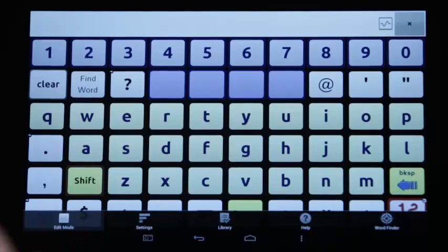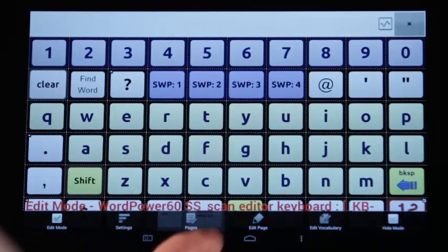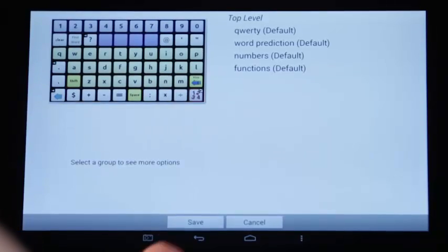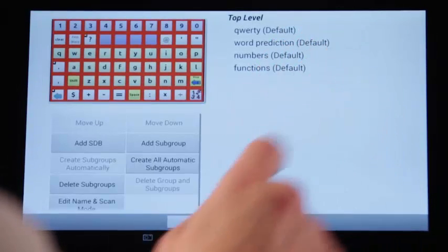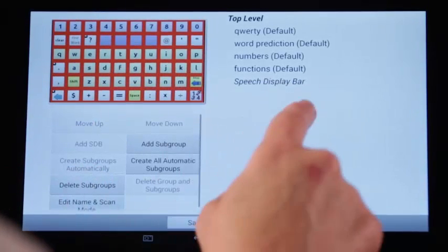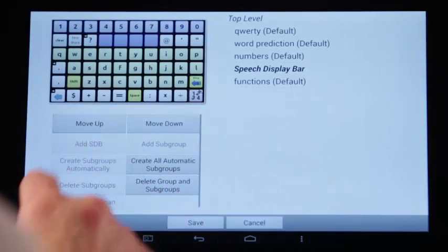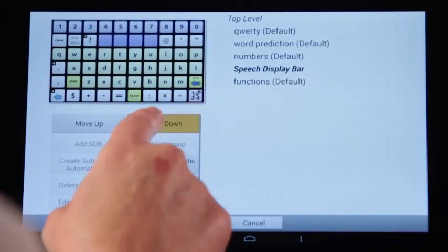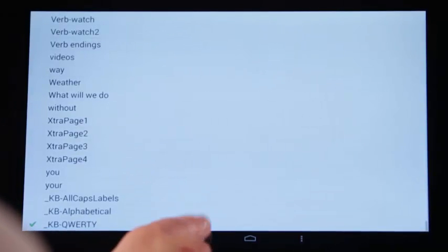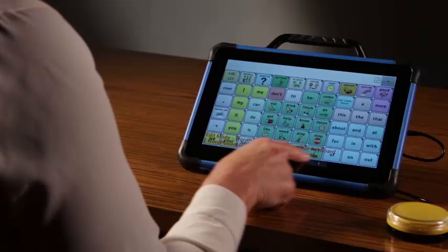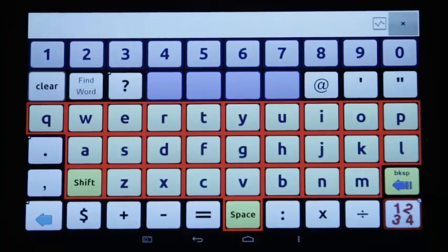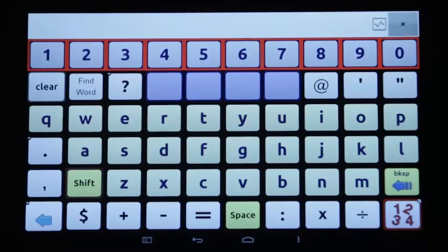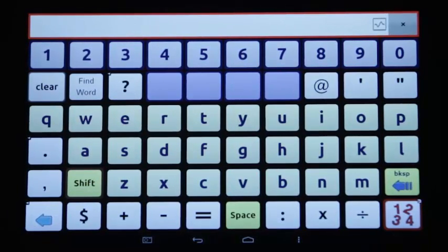I can add the SDB to the scan and change the order of the scan by moving the items up or down. Tap Menu, Edit Mode, Pages, scroll to KB QWERTY. Tap Scan Editor and decide when you want the SDB to scan and move it up or down in the list. Tap Save, tap Save, arrow back to the vocabulary and exit Edit Mode. Let's take a look at the scan. Keyboard.